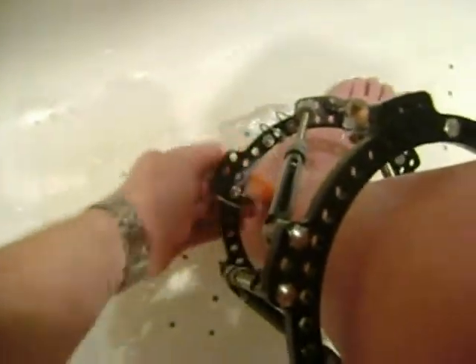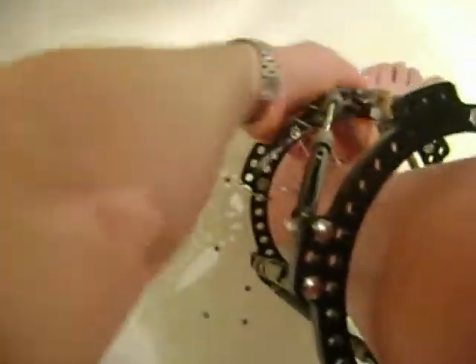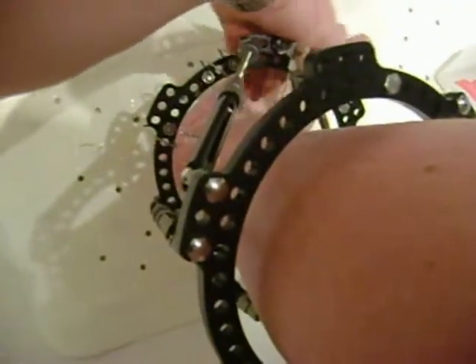This is actually just a piece of spare bandage which is clean — it's wet, I've just soaked it in chlorhexidine scrub, the kind you use for theatre. And all I do now, quite literally, is just go in and around the pins with the bandage. I wouldn't normally do this with the shower head on.